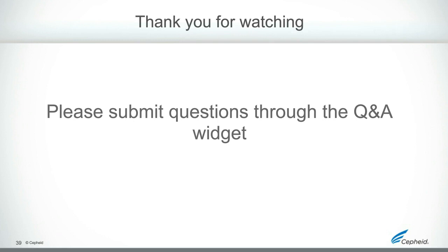So the way that NHSN recommends that you choose your testing methodology in terms of calculating your SIR is the most prevalent method. So whichever method you use the most or is your predominant method. So that doesn't preclude you from using another method, but you ultimately would need to go back and look at your data and look at which method am I utilizing most.